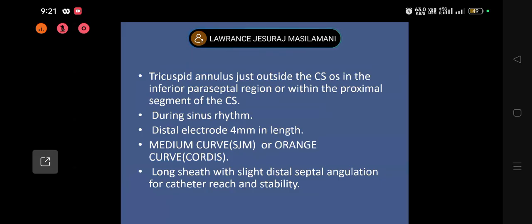But I don't use them commonly because when you use Mullins, this problem is taken care of. When you use a Mullins catheter, you can take a medium curve catheter and even ablate with larger prominent eustachian ridges also. So I use mostly 100% medium curve of Abbott for ablating AV nodal reentrant arrhythmia. You can use a long sheath, which is optional in most of the cases. Why do I use it 100%? Because it makes your life much easier.